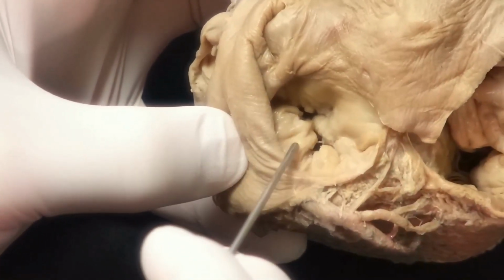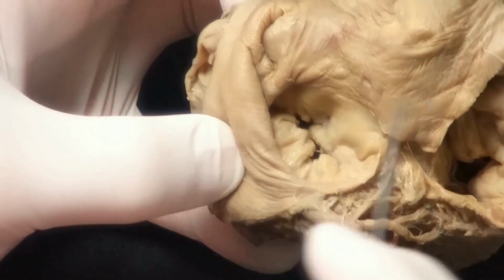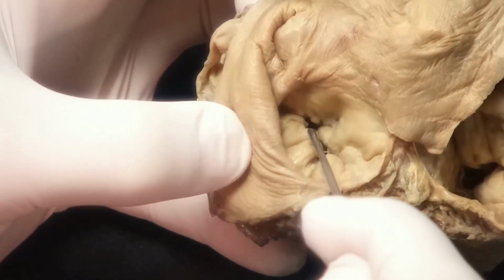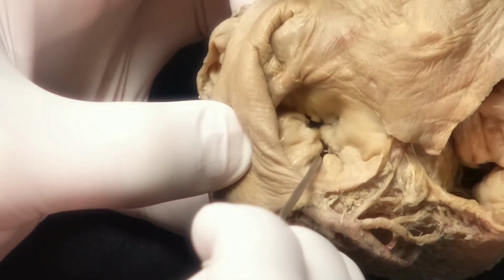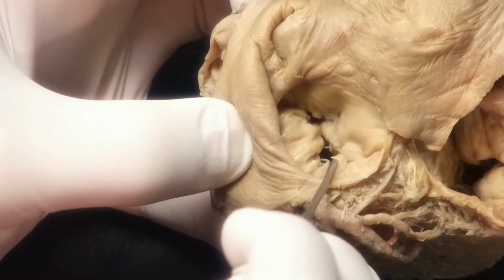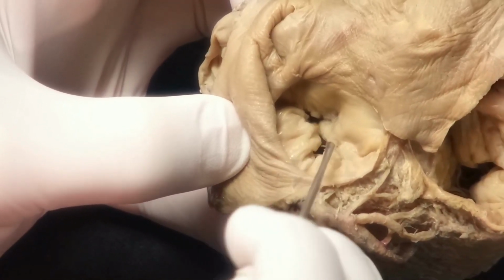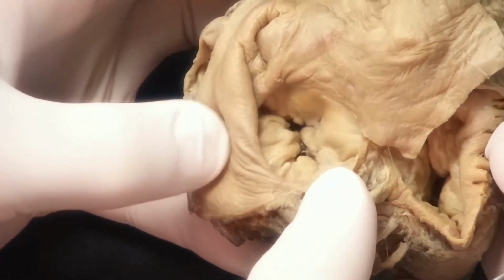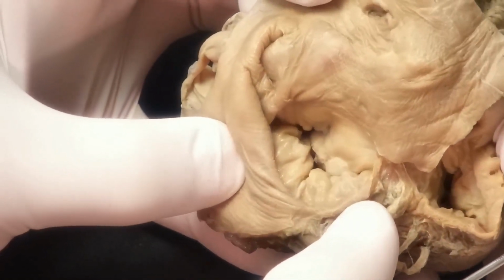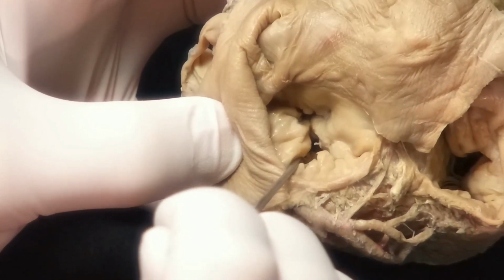Now, people aren't clipping this region, so edge repair of this region, but these can be important because if you place a clip adjacent to that, then of course you can pull this region apart further, and then you may have additional regurgitation or increased regurgitation through this region. So undoubtedly they're important with respect to edge repair, but I would term these accentuated folds.